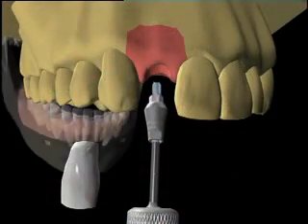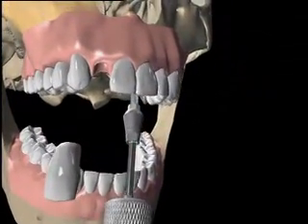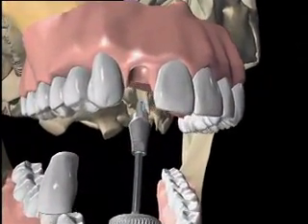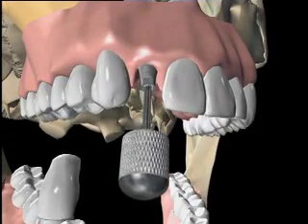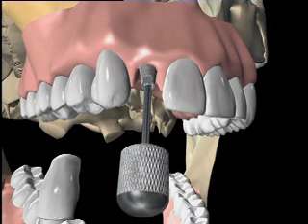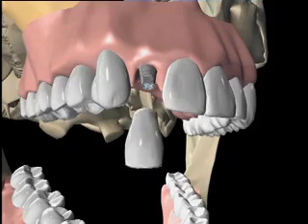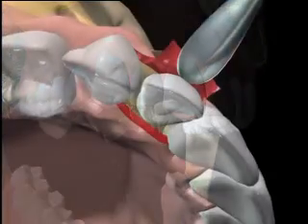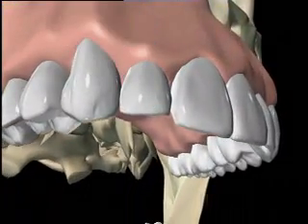The prepared abutment and temporary crown that were fabricated prior to surgery are delivered to the implant. The abutment is finger tightened on the implant at the time of surgery. The screw channel is blocked out using traditional techniques, and the temporary crown is cemented into place. The surgical specialist ensures no occlusal contacts are present and that the surgical site is thoroughly cleaned of cement.